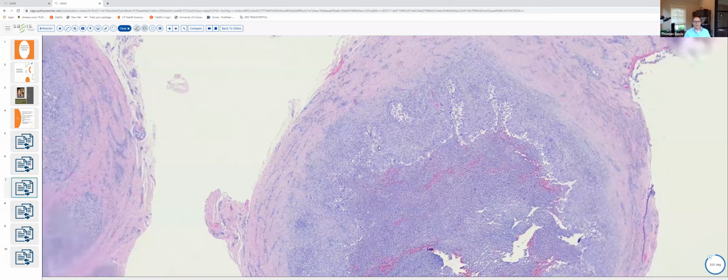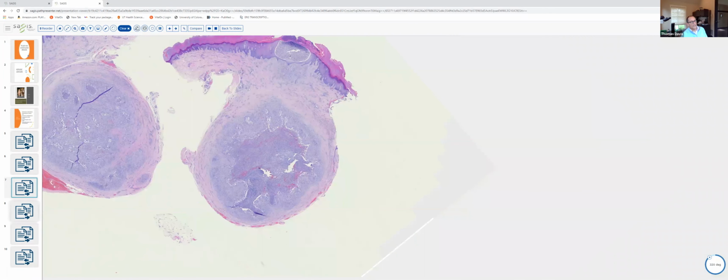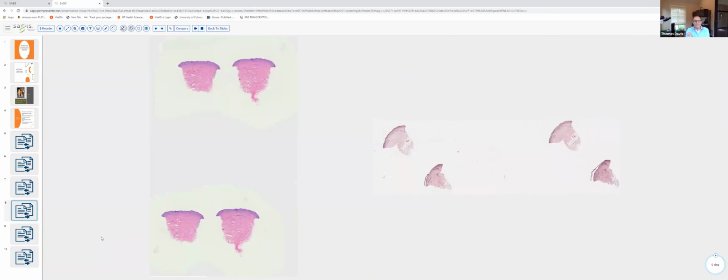So generally, just keep in mind that in distinguishing Phaeohyphomycotic cyst from chromomycosis, the clinical presentation, the host response, and the morphology of the organisms is going to be different, but they both are caused by pigmented fungal elements. Okay, let's go ahead and move on to our next differential.